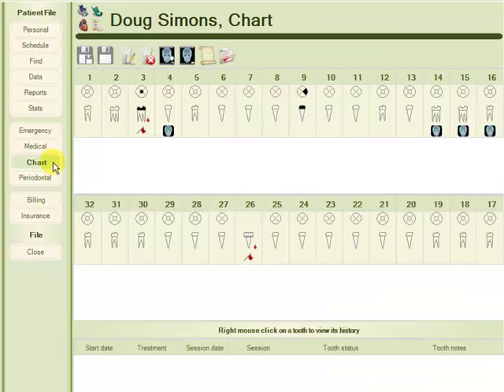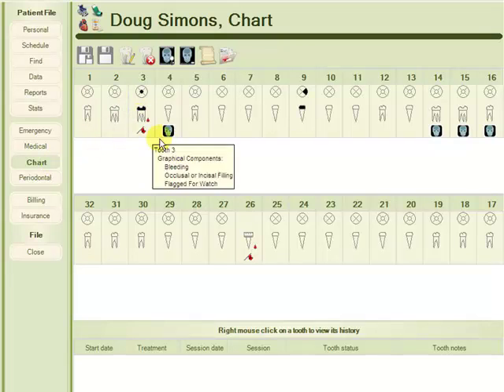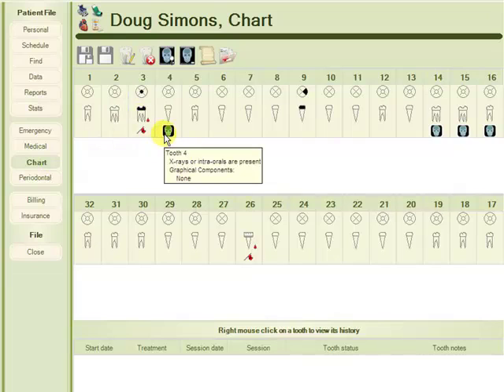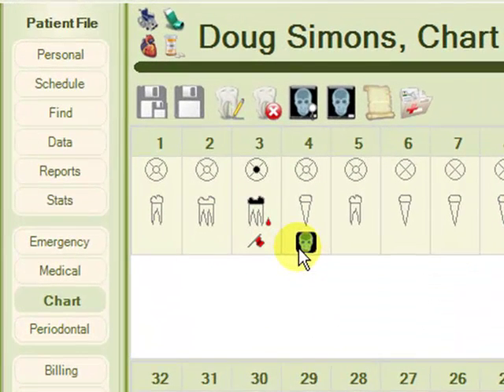The chart provides us with a visual reference of this patient's teeth, including such things as fillings, crowns, extractions, bleeding, etc., and what we will be examining in this tutorial, which is X-rays and intraoral images, identified by this X-ray icon here.